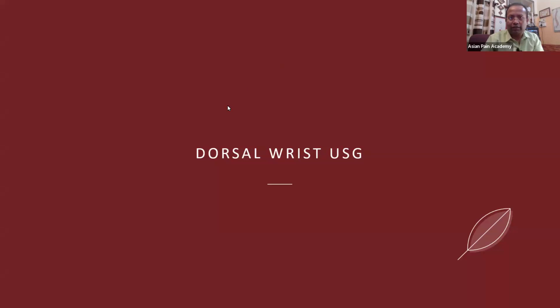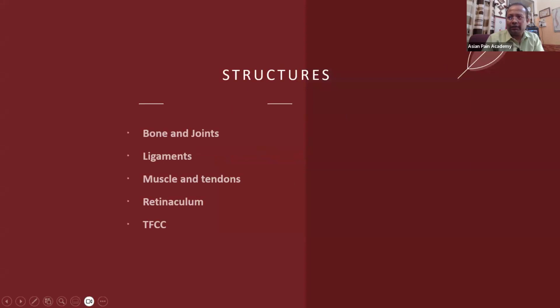Okay. So first thing, today we are going to talk about wrist ultrasound and dorsal side, not the ventral side.